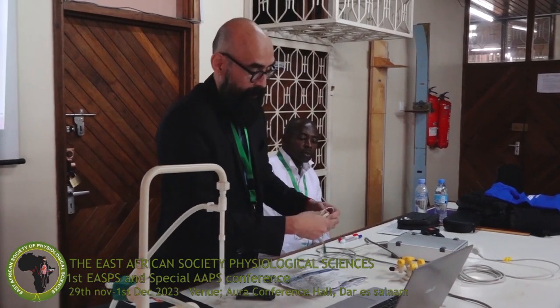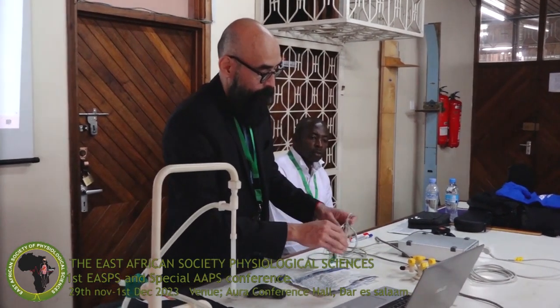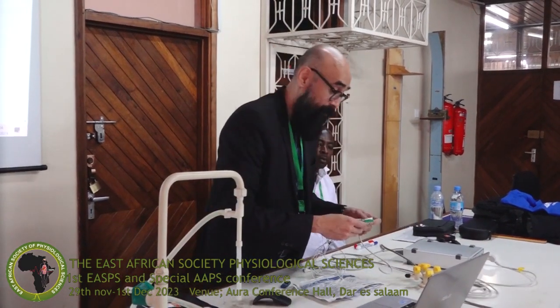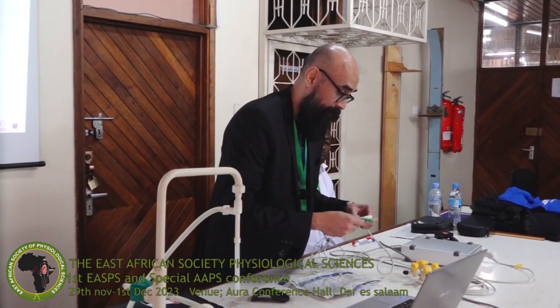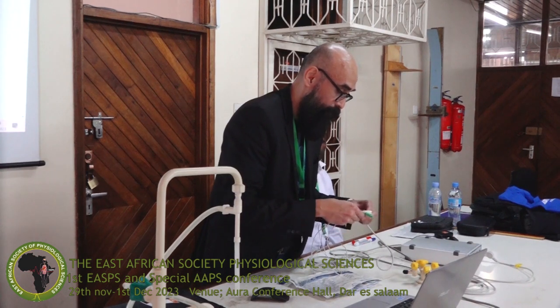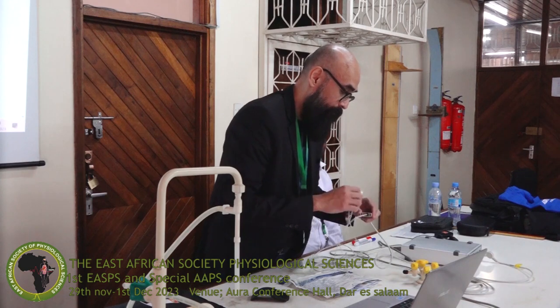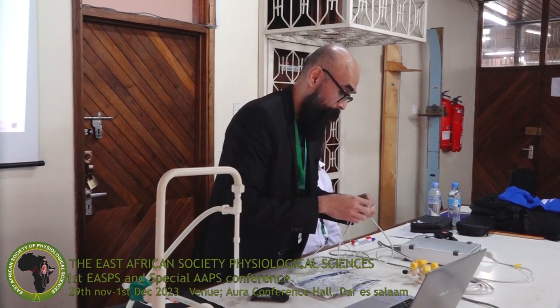And we are going to add the electrodes. So with all these parts, if you notice, everything is labeled and indicated in a way that the student will be able to identify what kind of connectors they need to put in place.